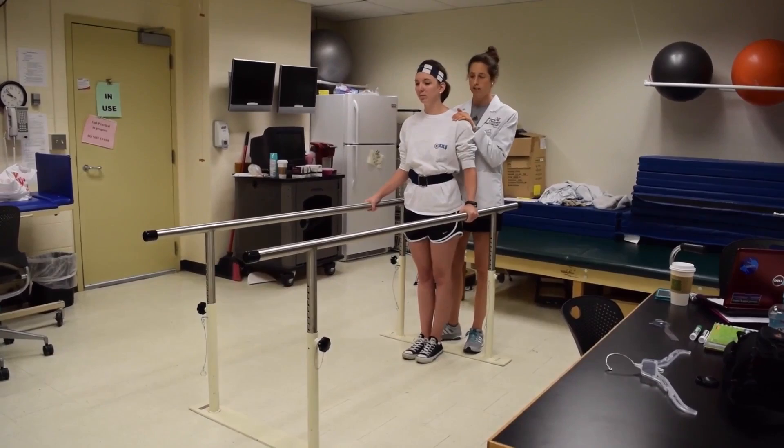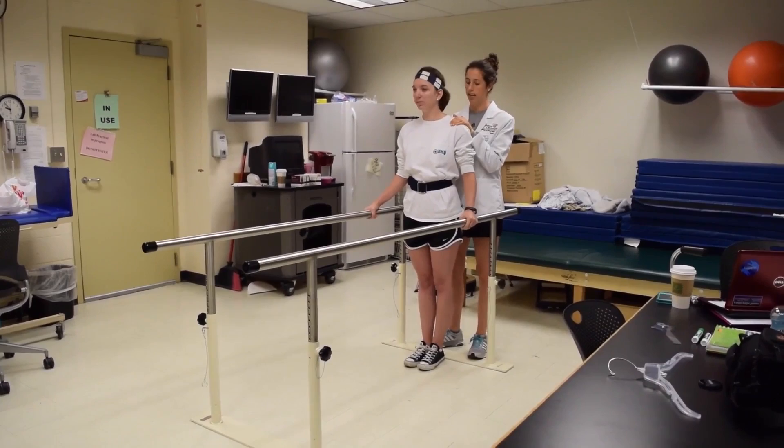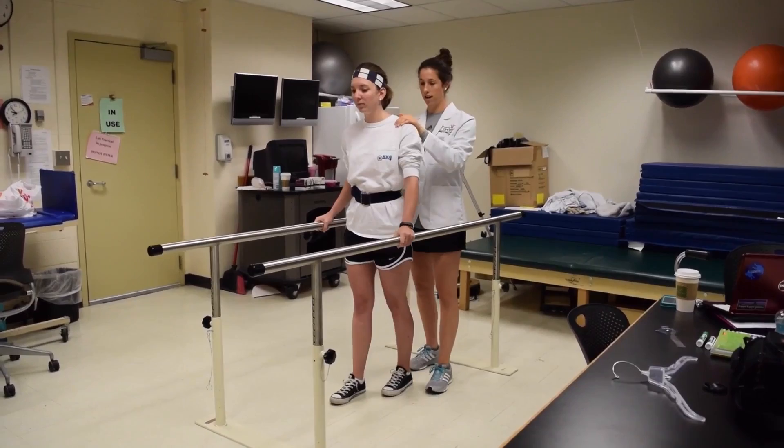Courtney, are you ready to start? Which leg do you want to step with first? Left. So we're going to do left leg first, followed by her right arm. On the count of three — left leg forward, then followed by that right arm, then bring that right leg and left arm, and then bring them together.